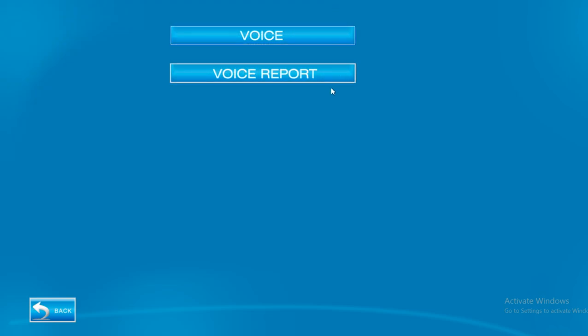This is known as the real-time voice analysis, which is very, very important for a clinical setup of any clinic or an institution or an organization. And this is also used for research purposes and in various universities for students doing master degrees, as well as for people who can even try to do PhD programs.